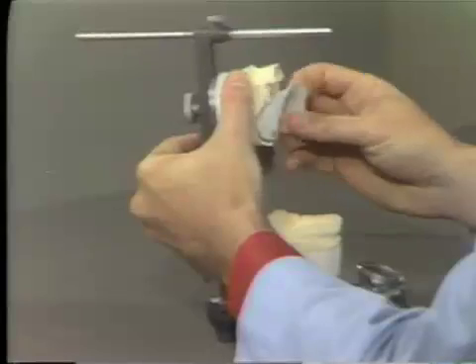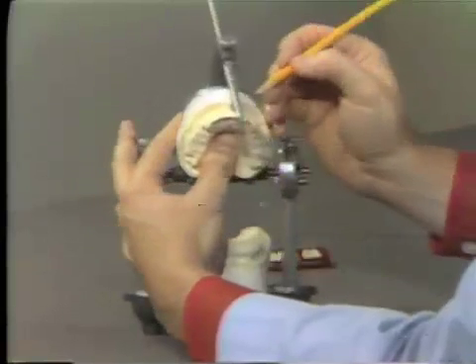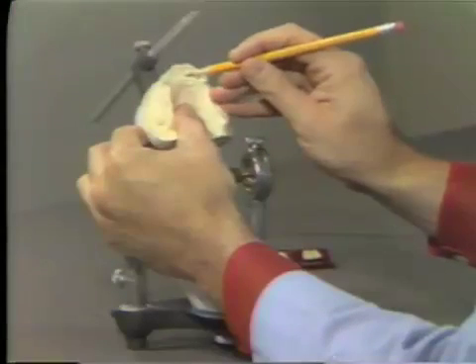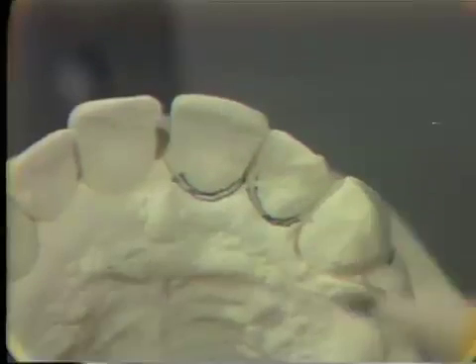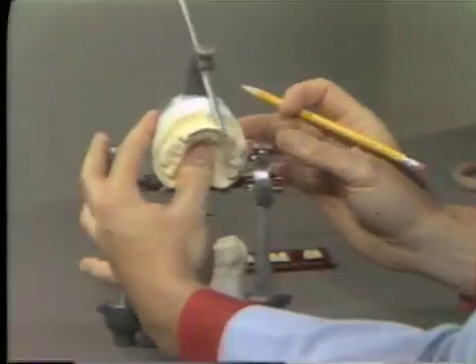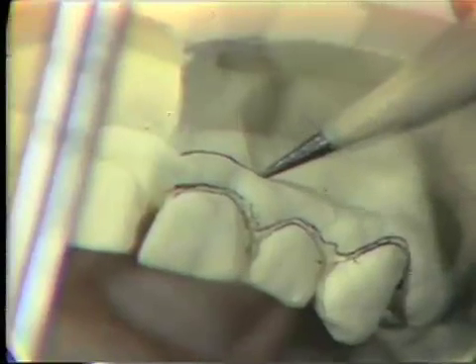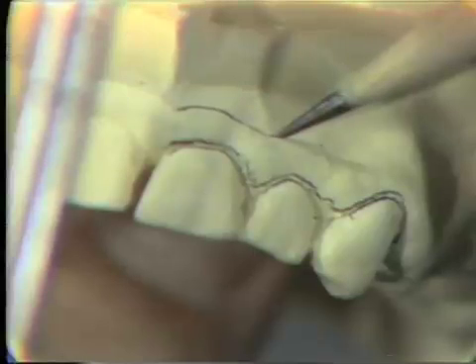The first step in setting anterior teeth for an immediate denture is to carefully mark with pencil the gingival sulcus area around the teeth. I'm marking the sulcus here on the labial and also the lingual gingival crevice, so that when we remove these teeth from the stone cast we can see exactly where the gingival area was. On the labial anterior area, I'm also going to mark a second line, approximately two millimeters apical from the gingival line that I drew.